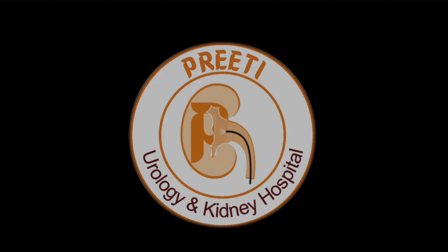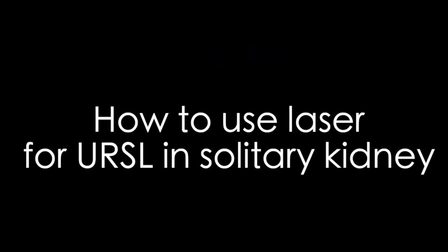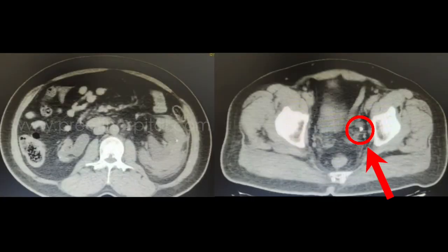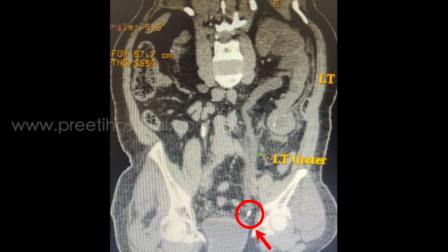The aim of this video is to show how to use laser for URSL in a patient with solitary kidney. The patient is a 60-year-old male who is a recurrent stone former with a left solitary functioning kidney. This is the CTKUB showing an 8mm stone in the left distal ureter.